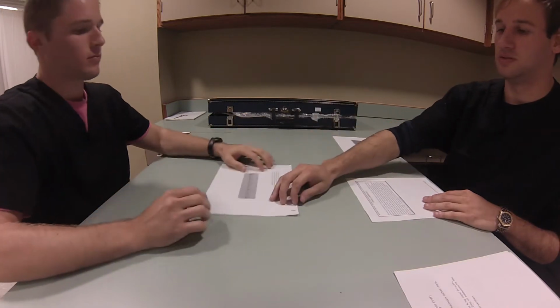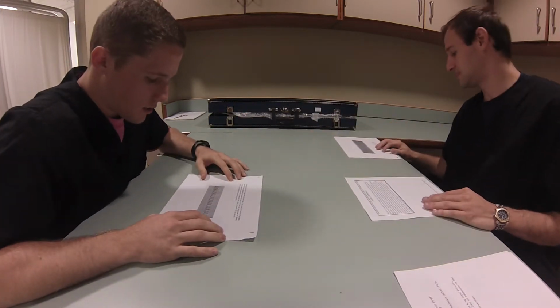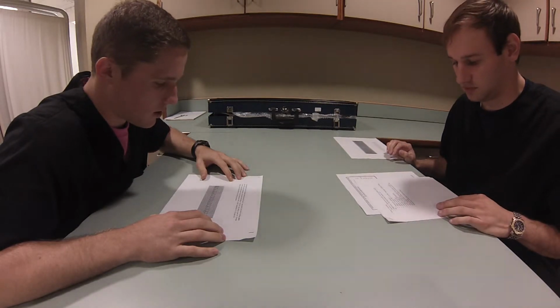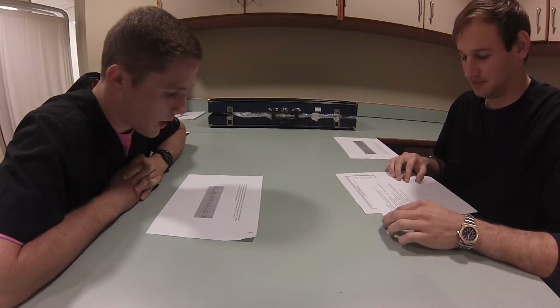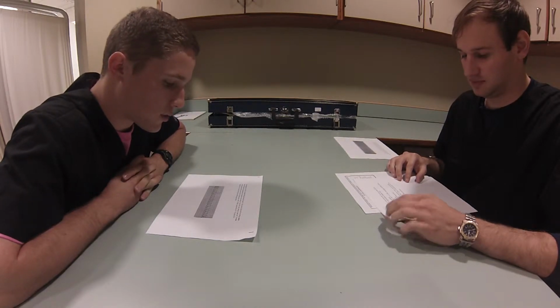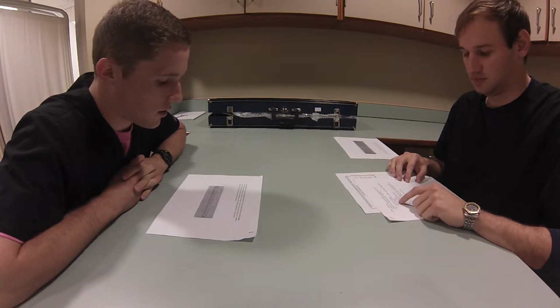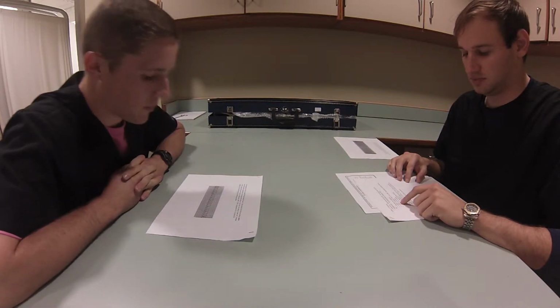Case 1. This is supraventricular tachycardia, SVT. You respond to a 49-year-old female feeling faint and weak. Upon arrival, you find her sitting against the wall, awake, complaining of dizziness and stating, "I feel like I'm going to pass out." She has a weak, rapid pulse, and her skin is diaphoretic. Blood pressure is 100/60, respirations are 20. You place the patient on the monitor and identify the following rhythm.